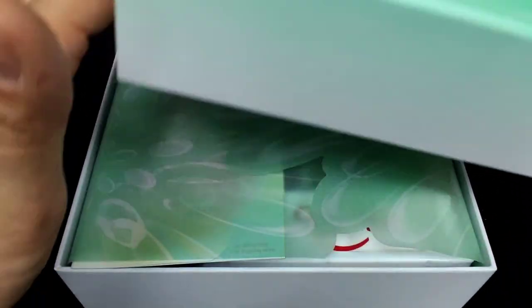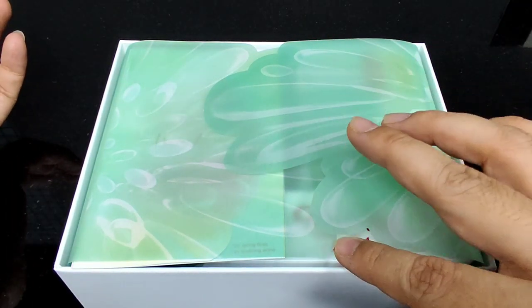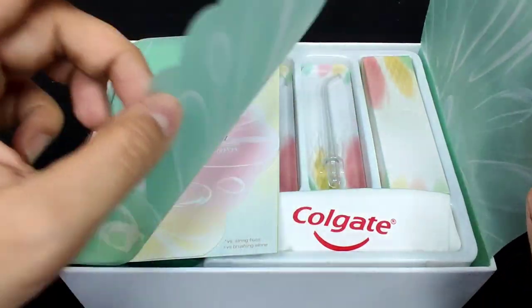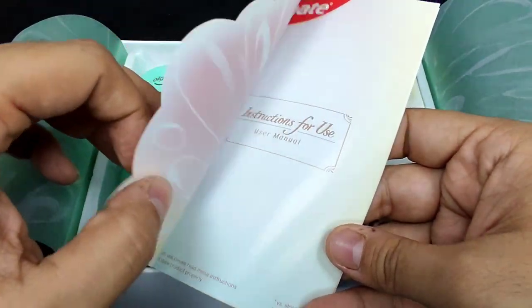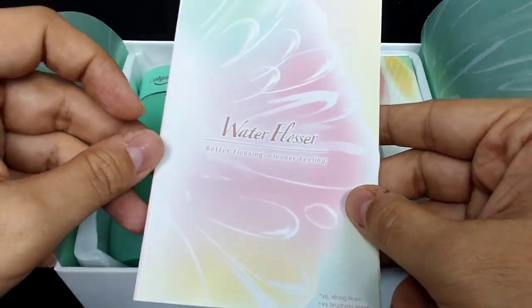Let's open it up, and this is what you see inside. It's a premium product, which is why it shows this beautiful droplet design that continues when you unbox it. You also have an instruction manual that follows the same theme, which makes it look even better.